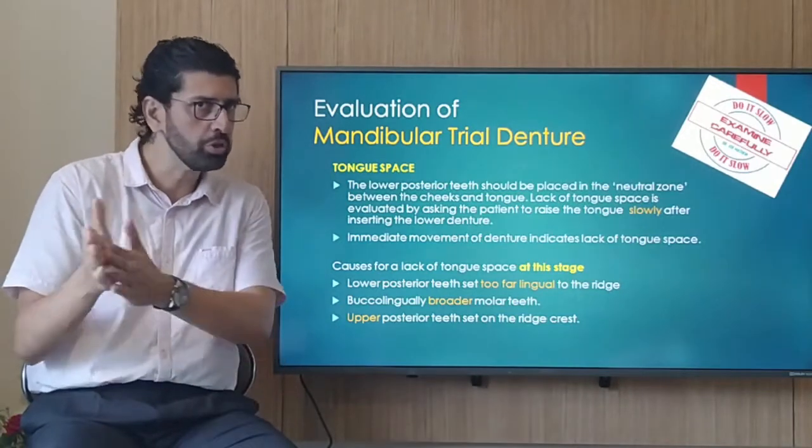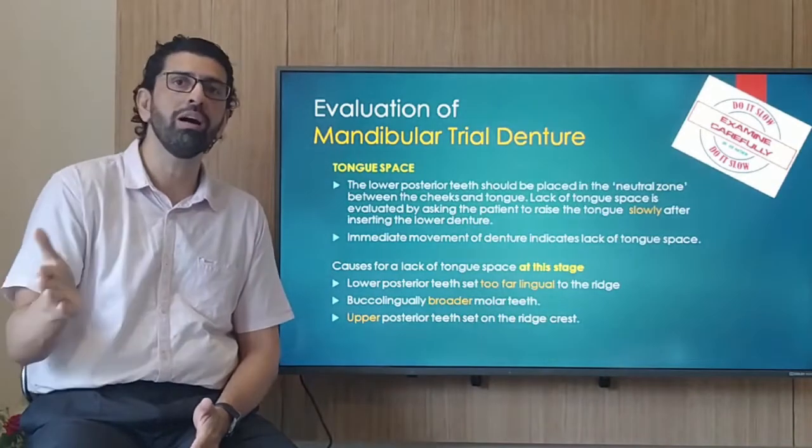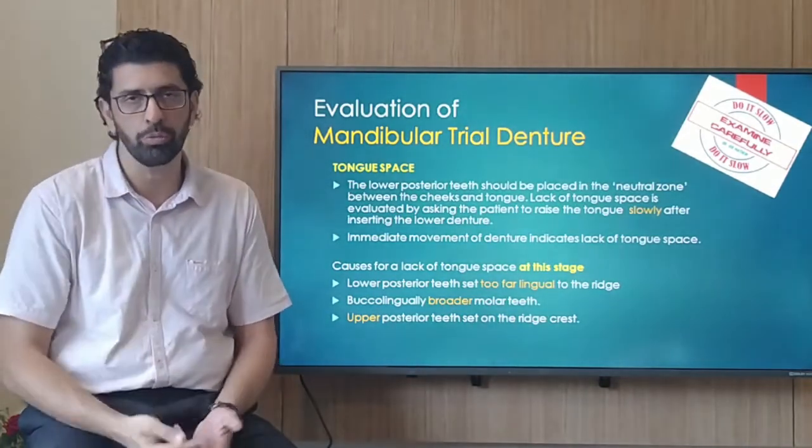Not the jaw relation. At the jaw relation stage it is fine. So at this stage, well, one, you set the teeth too far lingually in. That's one thing, like I told you before.